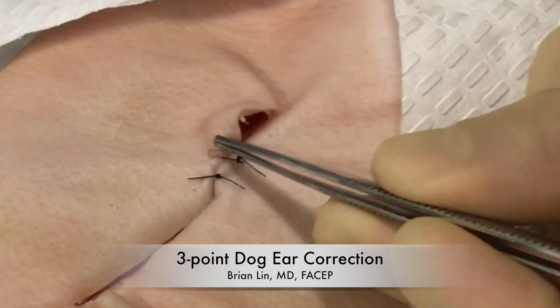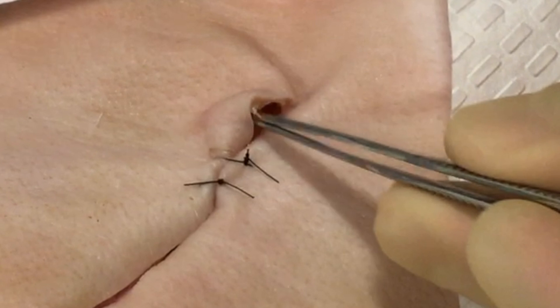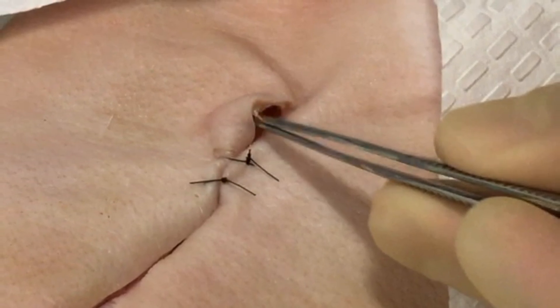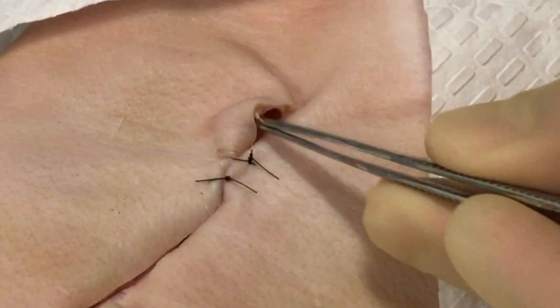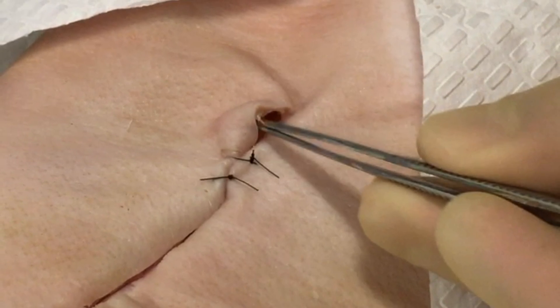This video outlines a recently described technique for correction of a dog ear. A dog ear is an infrequently encountered complication in emergency wound care, but can occasionally occur when wound edges are not symmetric, leaving one side to look floppy and kind of hang over the other edge — what we would refer to as a dog ear.